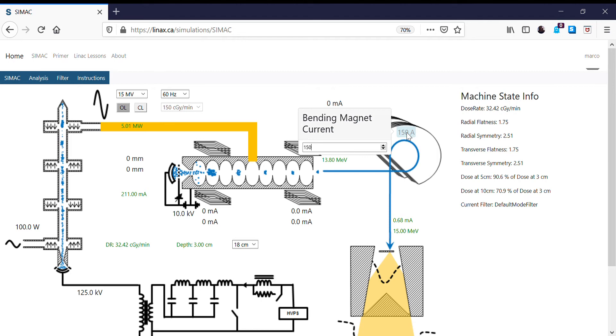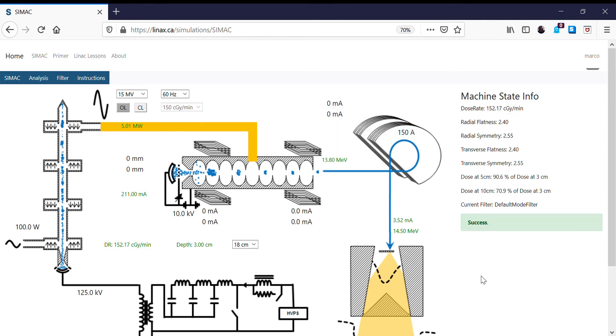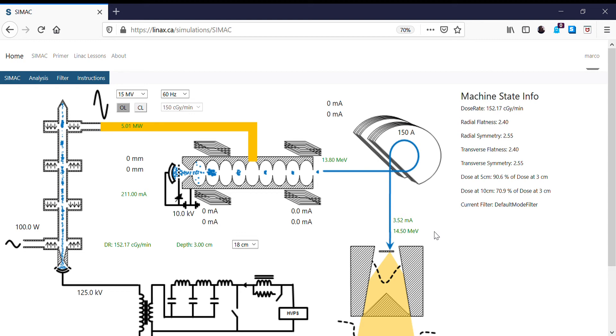And now we're going to watch our target current. We have 0.68 milliamps. When I hit enter, that's now going to go to 3.52 milliamps. So now we have a higher beam current, and that's because the energy of the electrons striking the target is now 14.5 MeV, which is closer to the 13.8 that the accelerator is producing.